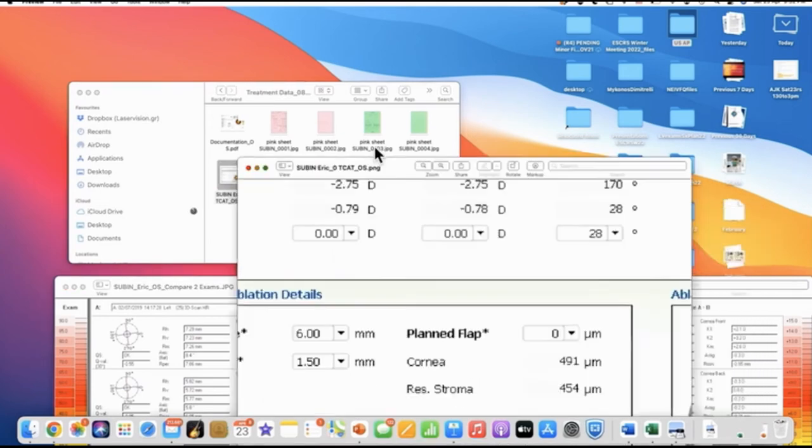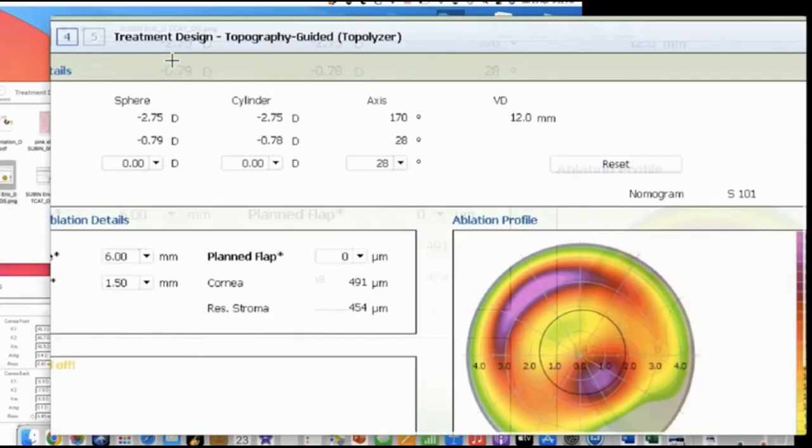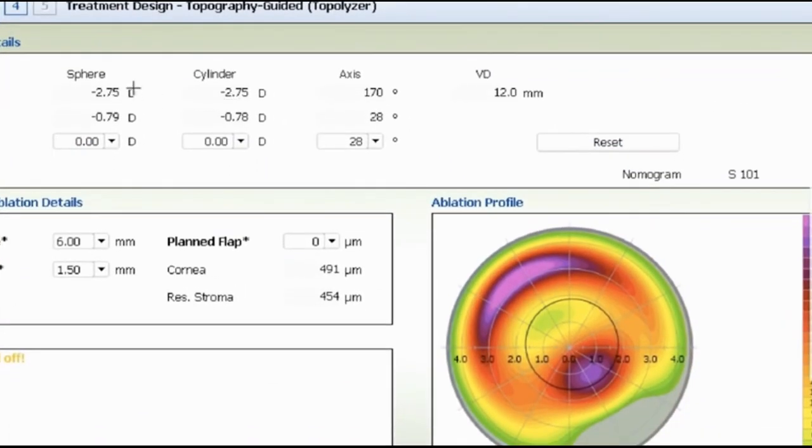So on this patient, I have his refraction, minus 3 roughly, minus 3 at 170. So the spherical equivalent here is minus 1.5 and minus 3, minus 4.5. Let's say minus 4. He's a minus 4 spherical equivalent. So what I would treat is, since I can only treat the diopter of astigmatism, I would do actually 0.75 at 28 degrees. So from the four diopters of spherical equivalent, that leaves minus 3.25. So I would probably treat 3 diopters of myopia.